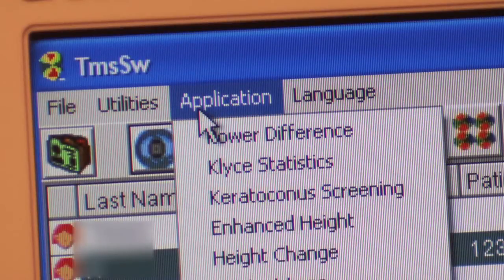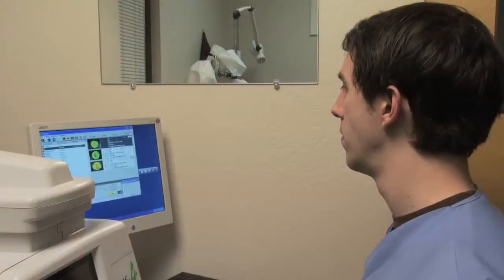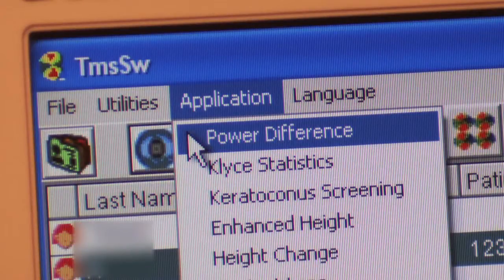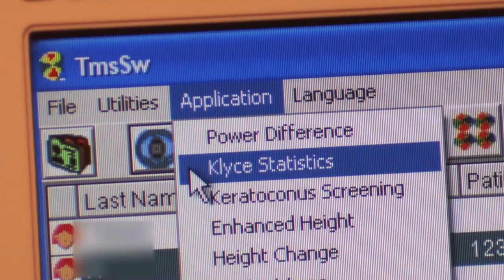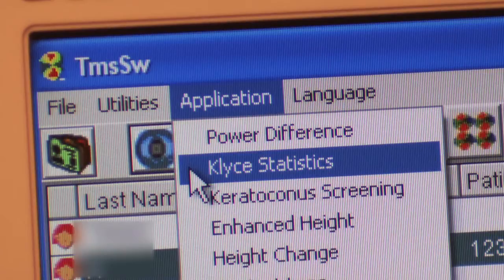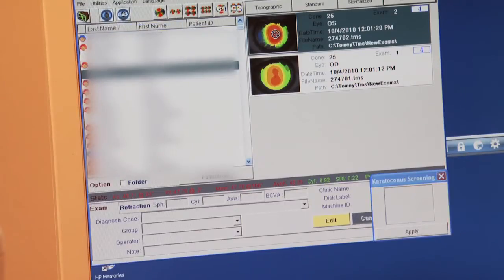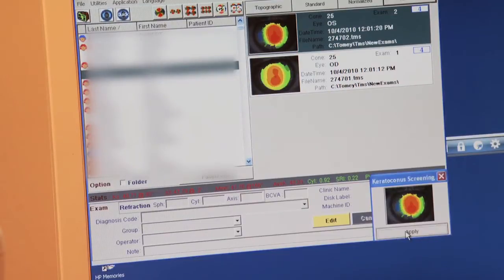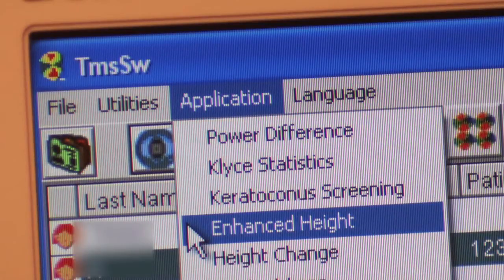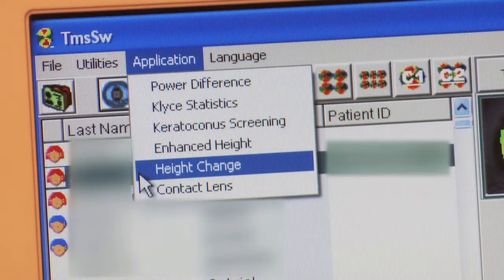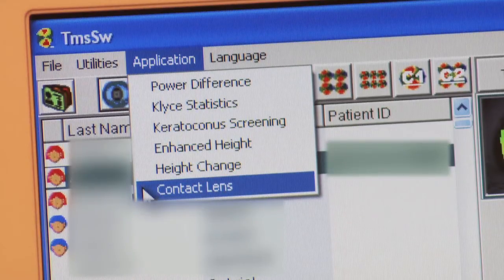The Application drop-down menu has six selections. Power Difference: after you have pulled both topo maps into the correct boxes, this choice will make a comparison between the two eyes and display a power difference map. CLI Statistics: after pulling an image into the box in the lower right-hand corner, it can be analyzed using the CLI Statistics method. Keratoconus Screening: placing an image in the lower right box will analyze it for keratoconus. Enhanced Height: place an image in the box to view it in Enhanced Height mode. Height Change: place two separate images into the boxes and the unit will display the difference in height between the two eyes. Contact Mode is available when the Contact Lens software has been installed. The last drop-down in this selection is Language.